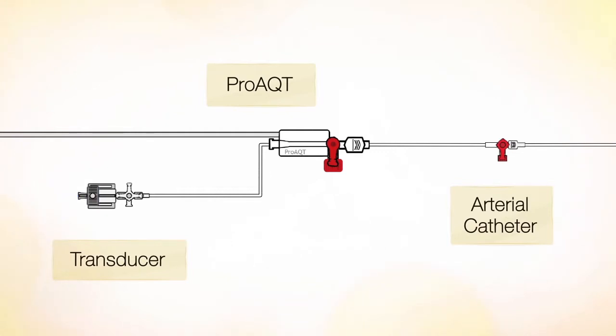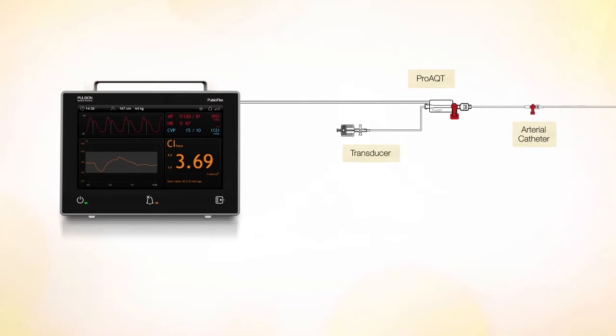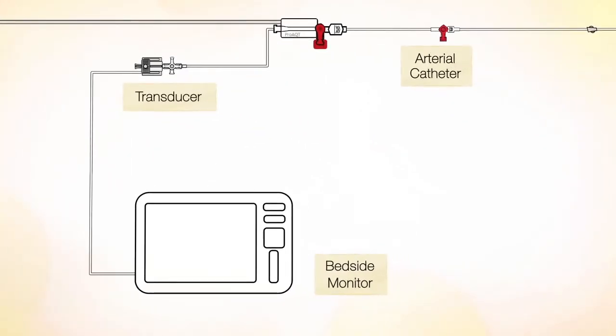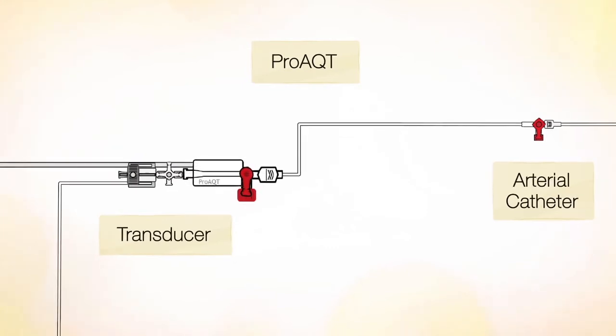Connect the Proact Sensor to the Pulseoflex monitor. Connect the standard transducer to the bedside monitor. You can connect the Proact Sensor either next to the pressure transducer or right on top of it.